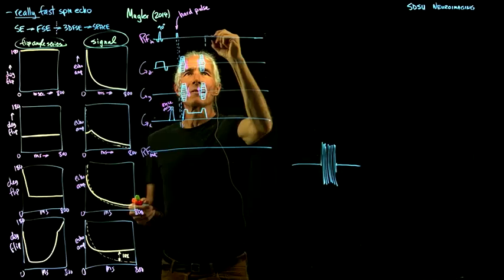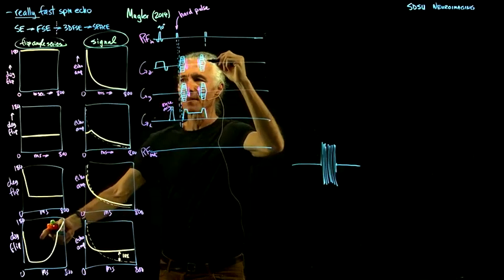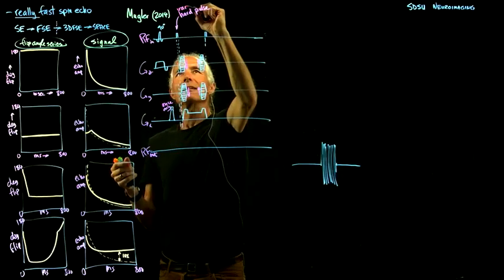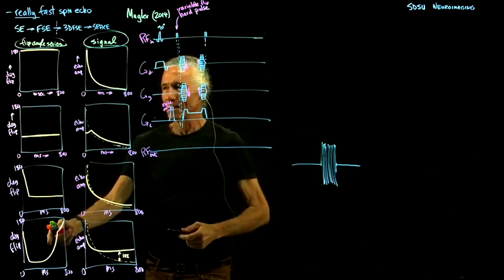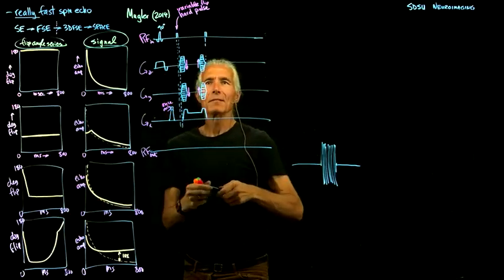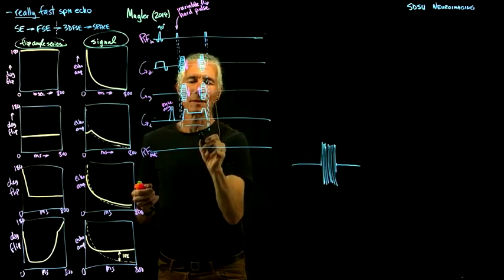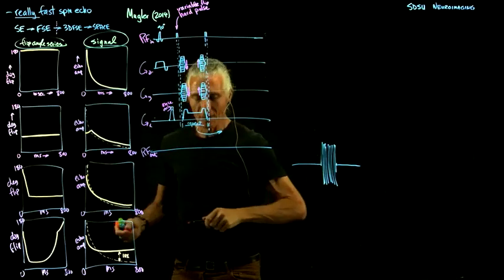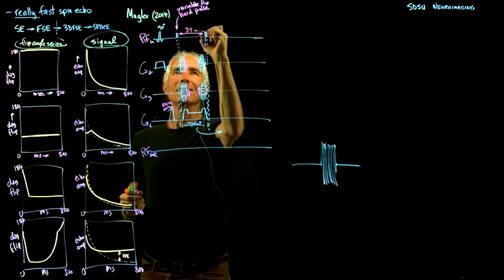And so now we're ready to go again. So now we just do another RF pulse. Now the amplitude of those pulses are changing because you're doing this to them. So these are variable flip, because we're doing this strange thing to them. But now they managed to jam everything down to, so now we're repeating. So here's the repeat. So they managed to jam everything down to 3.9 milliseconds. So that is really short.